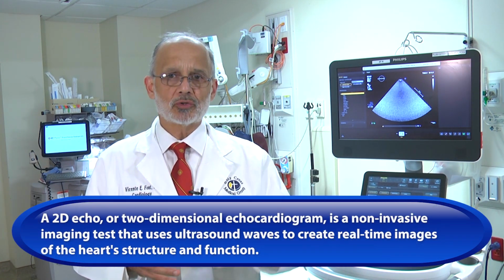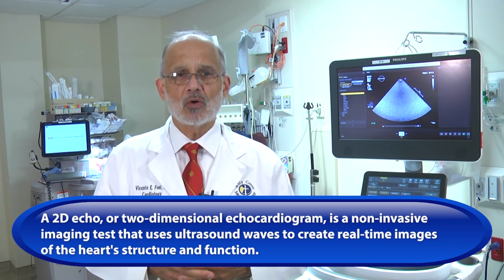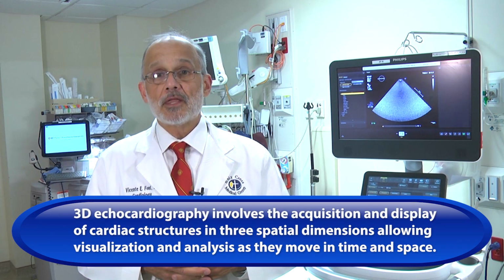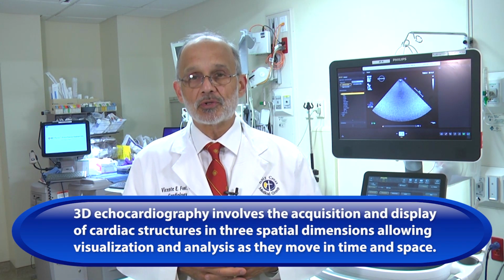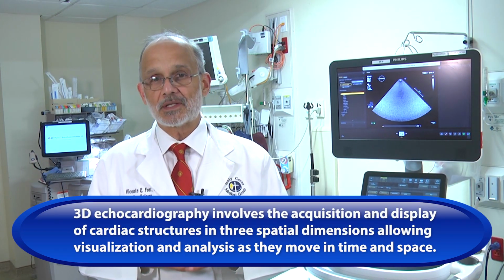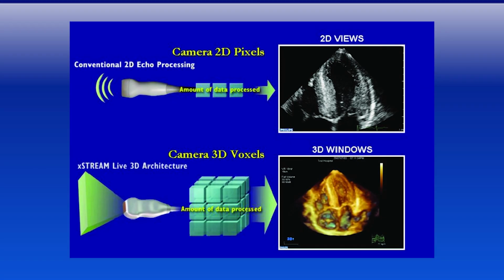There are many different types of modalities that we use with echo that we will not be talking about, but to give you an example, there is a so-called two-dimensional or 2D echo, which provides tomographic or thin slice imaging. 3D echo, three-dimensional echo, is another advancement in computers and transducers that offers a significant amount of additional information and is frequently used as a complementary tool to the other types of echocardiograms.